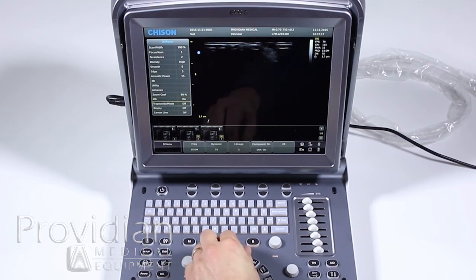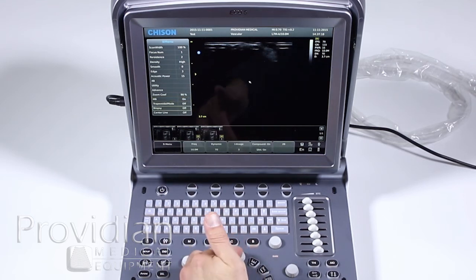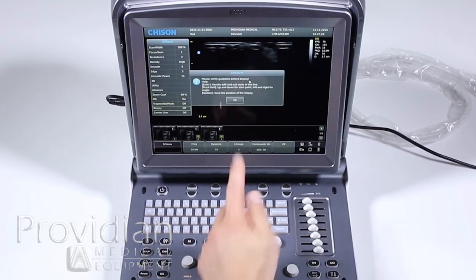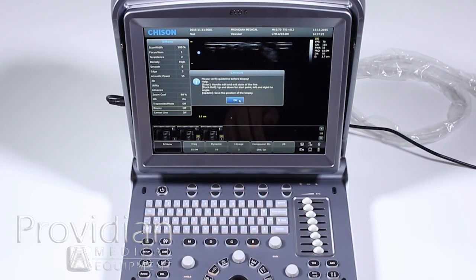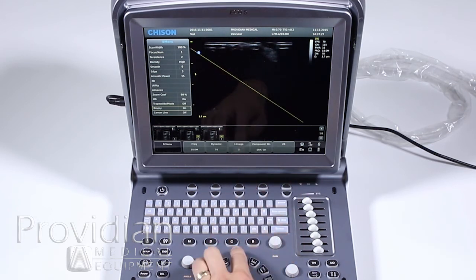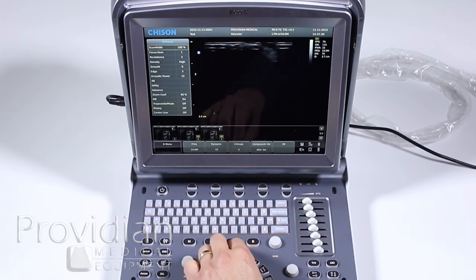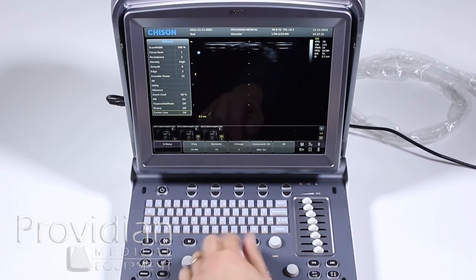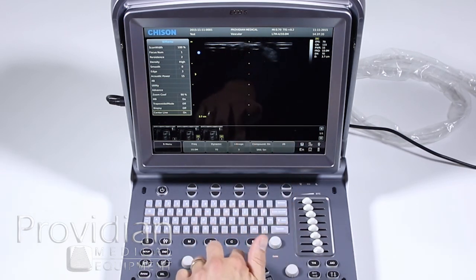From this menu, you can go to trapezoidal mode. For a biopsy line, push that option down — it gives a warning to make sure your biopsy guide is calibrated. Click OK and you have your biopsy line. Push down again to remove it. For a center line, push down the same way and you've got your center line.